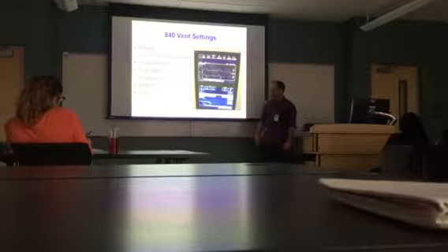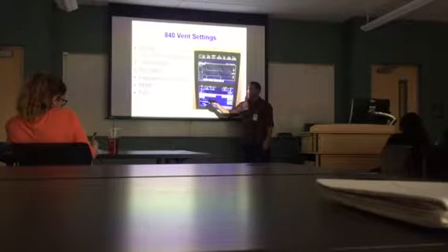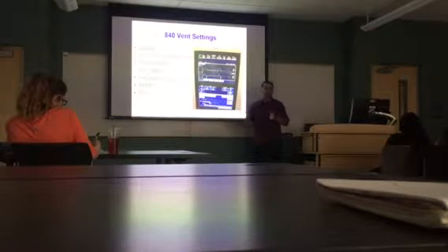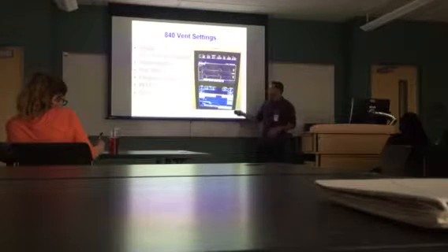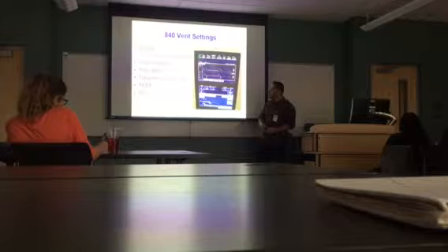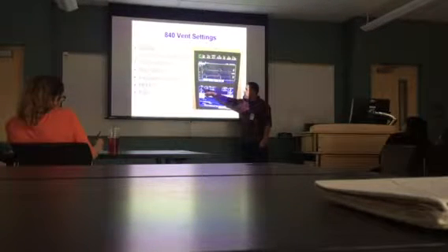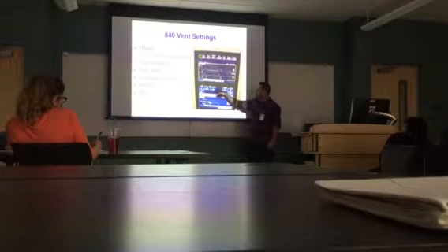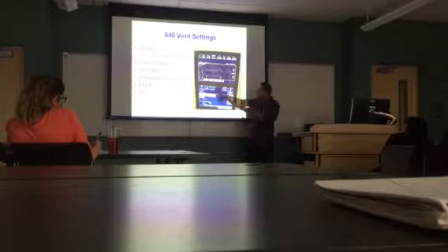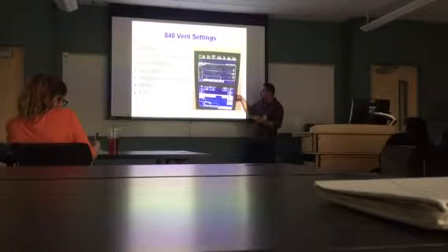PEEP and FiO2. PEEP is the positive end-expiratory pressure. So that's the pressure that's left inside of the patient's lungs at all times while they're on the ventilator. And then FiO2, fraction of inspired oxygen. So here you have your rate, indicated by the F. There's your tidal volume. Okay, this inspiratory time correlates with the flow rate. And then you have your FiO2, and you have your PEEP.